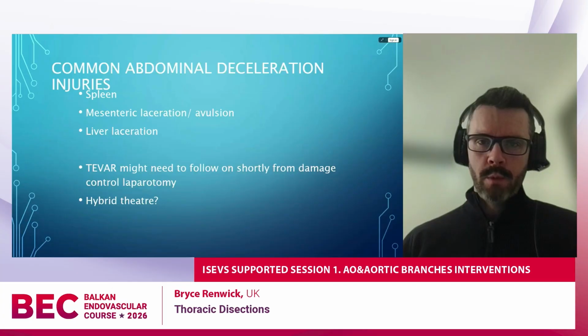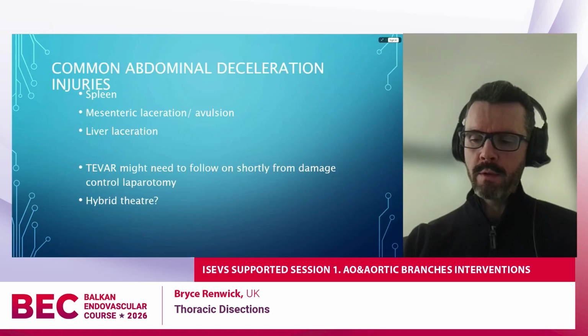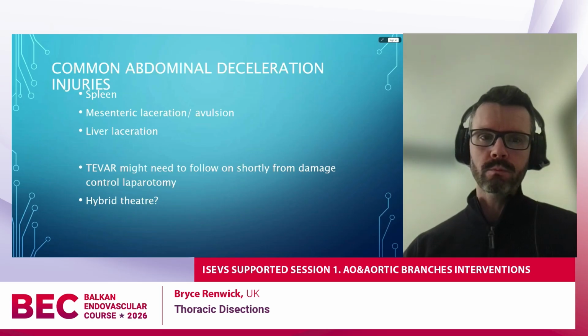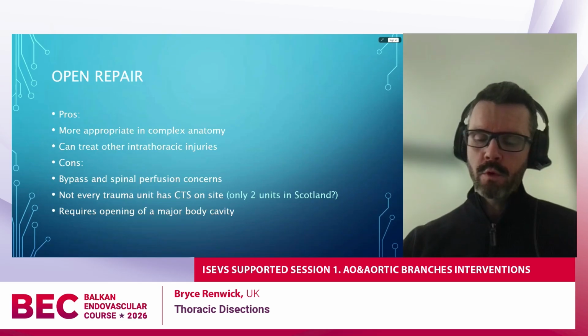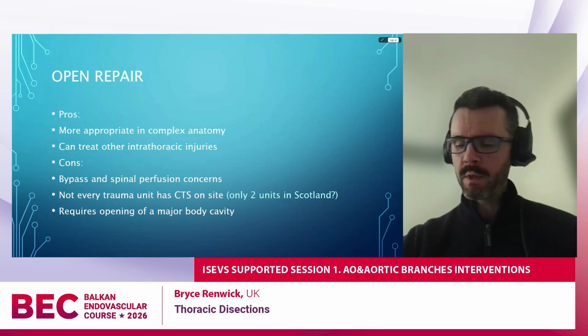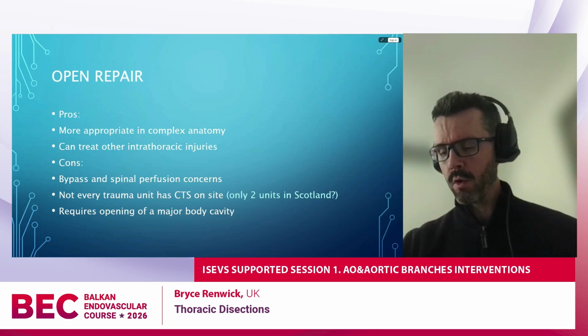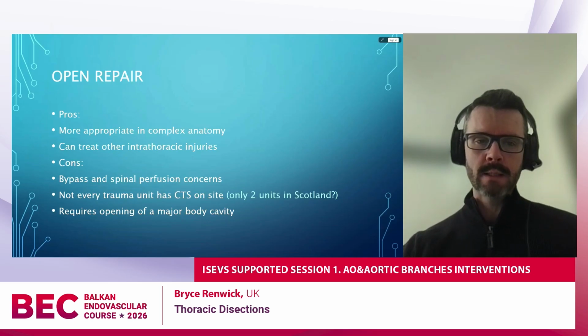So in these abdominal deceleration injuries, a TEVAR might need to follow on shortly from a damage control laparotomy. And of course, if you've got the benefit of a hybrid theatre, that's a much nicer place to treat these patients. Of course, open repair is always an option for thoracic deceleration injuries, but I think it's becoming less and less common with the advent of very reliable aortic stents.